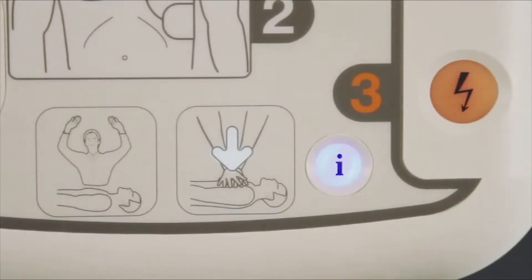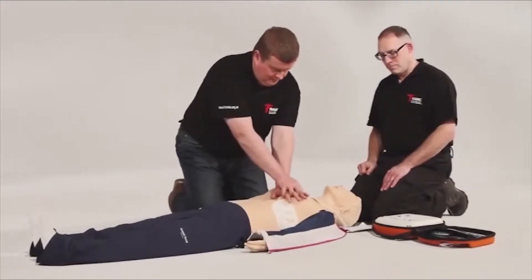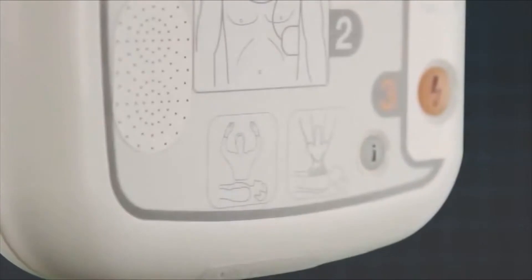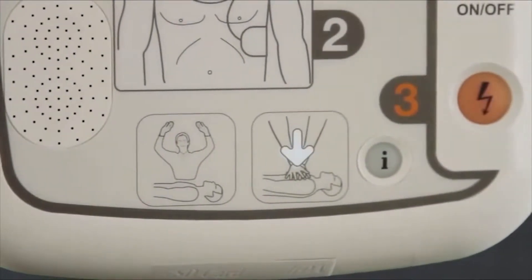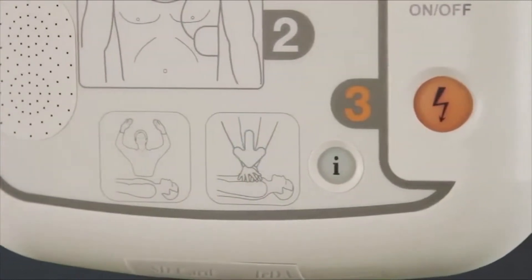The iPad SP1 AED will then prompt you to commence CPR. If you press the flashing blue I button, the AED will commence with CPR voice prompts. This includes a metronome for compression rate and a verbal command for when to breathe for the patient.